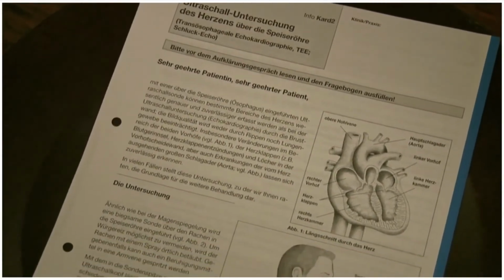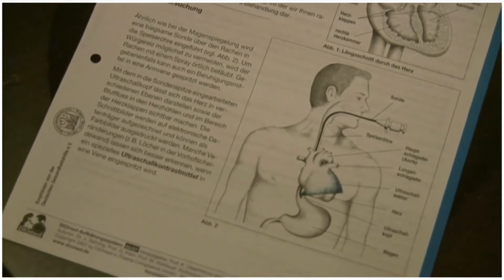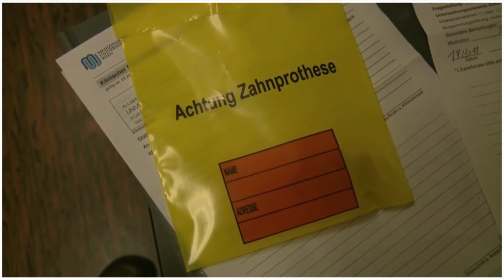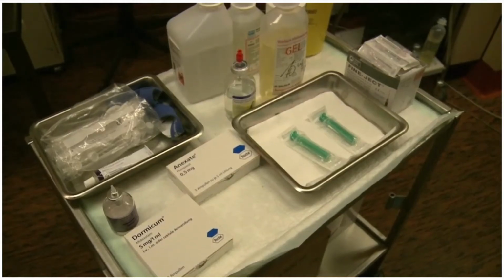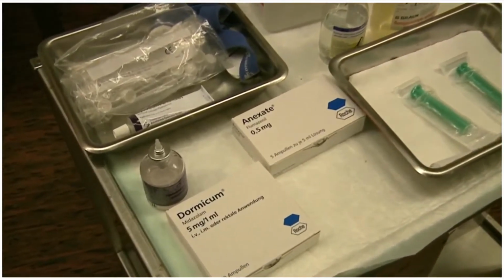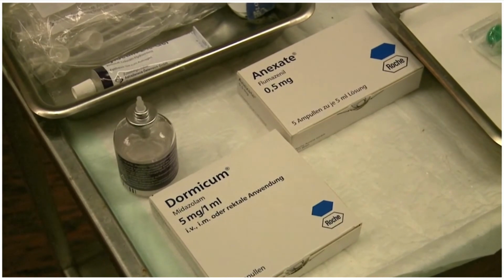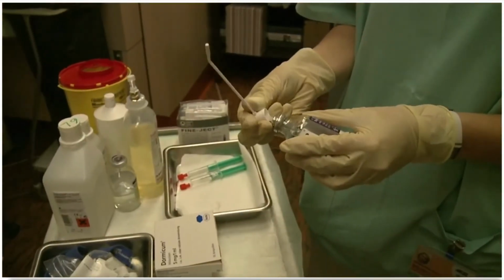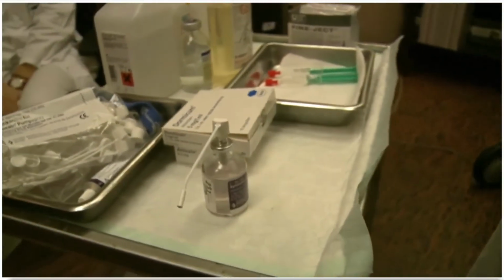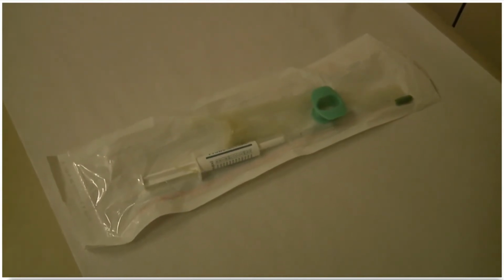First, we need to get written consent from the patients. So we have to explain to him what the procedure is like and what the risks of the procedure are. Patients have to take out their false teeth. Then we prepare the medication. What we use is midazolam for sedation, and we use its antagonist, flumazenil, to antagonize in case we need to. Then we use lidocaine spray to anesthetize the pharynx, and we cover the transesophageal probe with a condom.